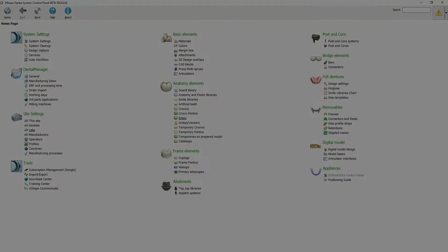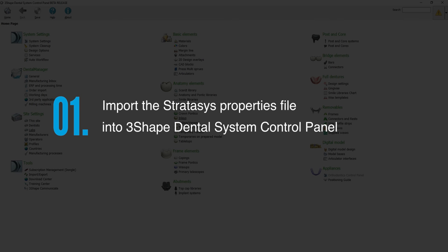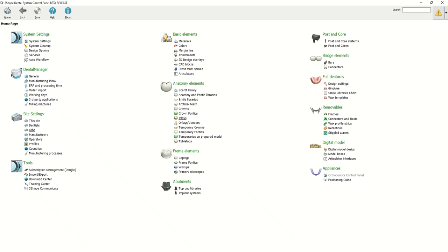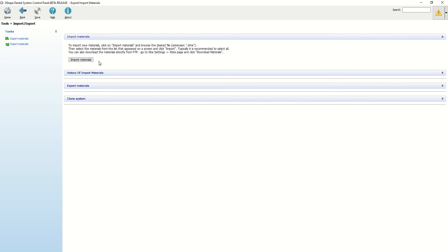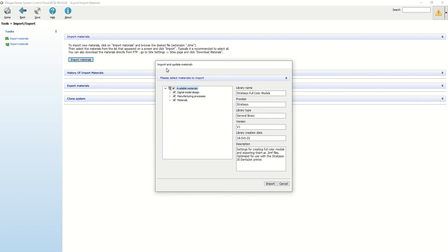First, you need to import the Stratasys properties file into 3Shape Dental System Control Panel. Open the Control Panel, select Import and Export under Tools and select Import Materials. Now locate and select the Stratasys DME file and import it. Click Import and close the Control Panel.